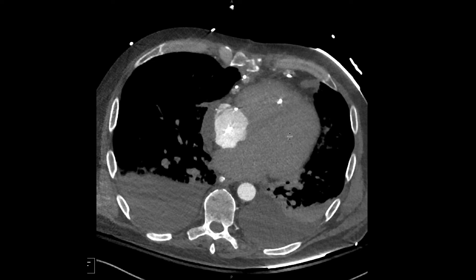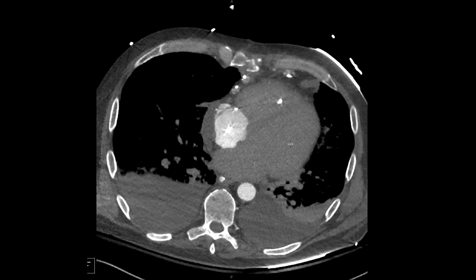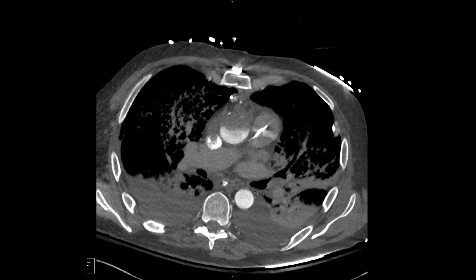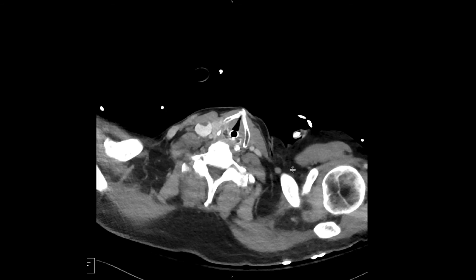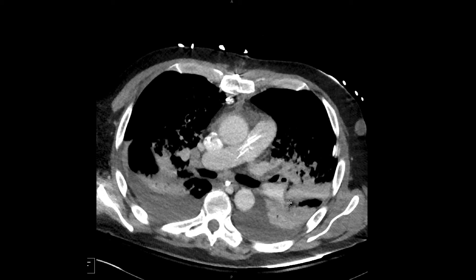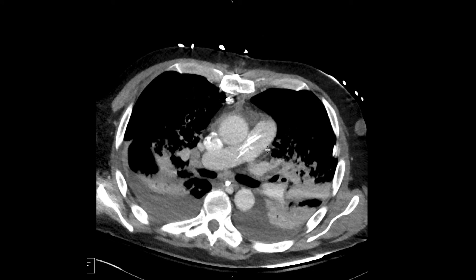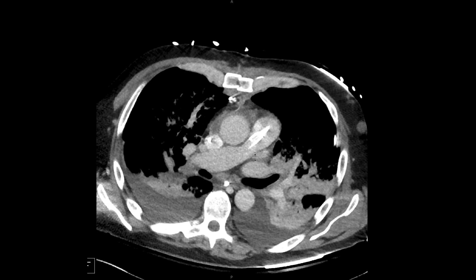Because contrast is taken from the IVC into the pump and replaced into the femoral artery with retrograde flow from the abdominal aorta into the thoracic aorta, one consequence is a pseudo-dissection appearance of the ascending aorta. Another consequence is zero contrast in the pulmonary artery despite good opacification in the atrium and descending aorta. The solution is to perform a delayed scan. Although contrast opacification will not be as good as a traditional pulmonary angiogram, there is no other way to get contrast into the pulmonary circulation.